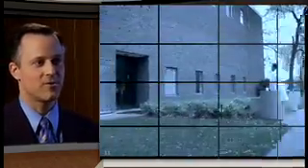So I'd have to run to photography, ask the photographer to pull the files, we'd have to find the photo file number, find the chart. Of course, if the chart wasn't upstairs, we'd have to go to the bowels of the basement to find it in the storage room, and if we were lucky, we could find it through that whole pile. Now, in the meantime, I have a patient sitting in the office for another 15-20 minutes while I'm running around trying to find these files. And that became a real problem, real hindrance, especially when you do it not just once, 2, 3, maybe even 4 times a day.